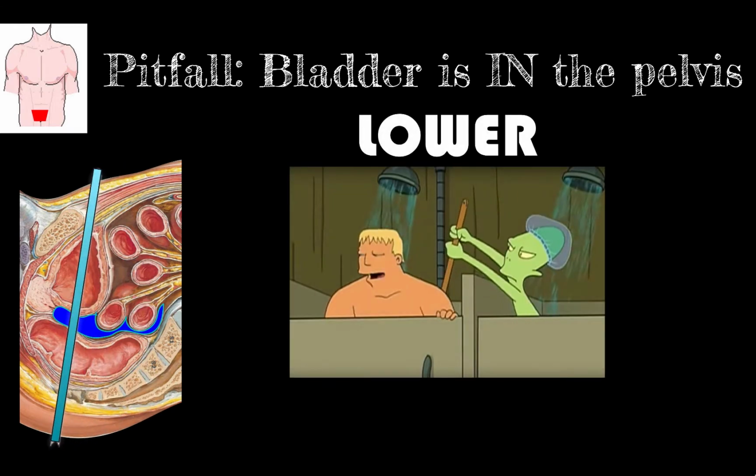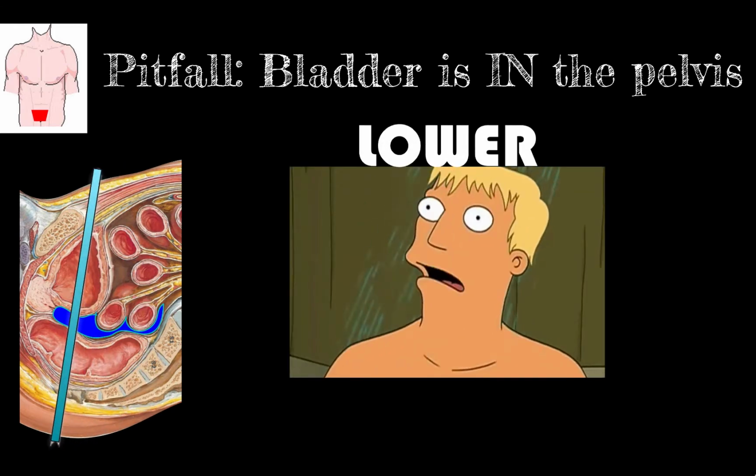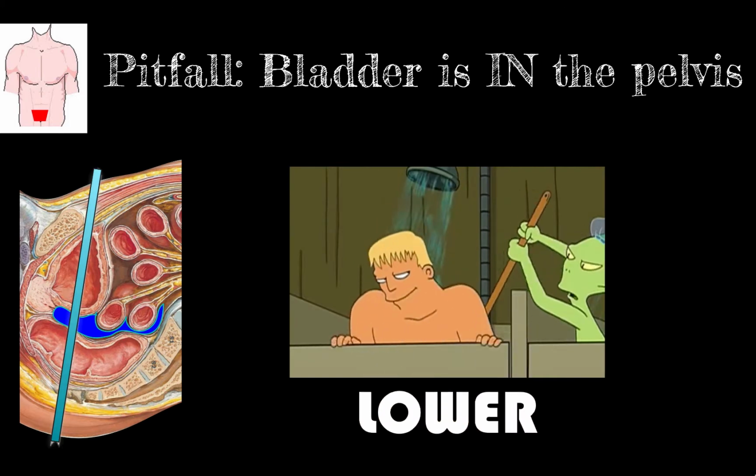As a result, people will often start looking somewhere just below the belly button, but you really need to go lower to see the bladder and the pelvic bowl. Lower. A lot lower. Too low! Lower. I don't really care if you don't get that reference, as long as it uncomfortably sits with you every time you do a FAST exam and you remember to go lower.